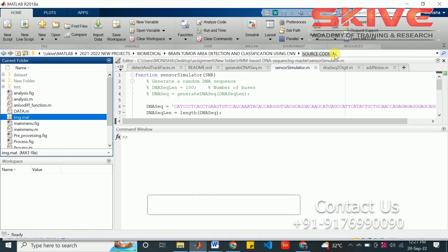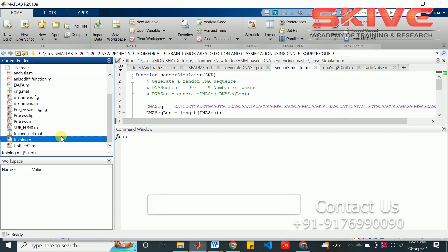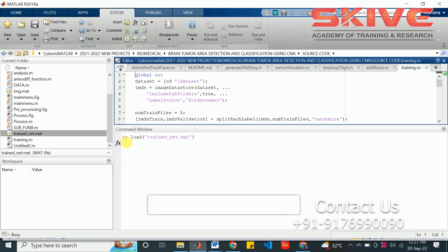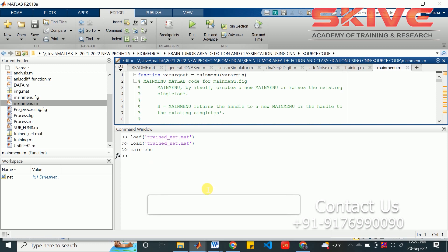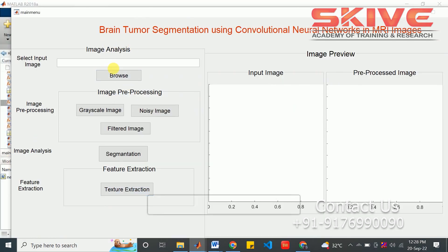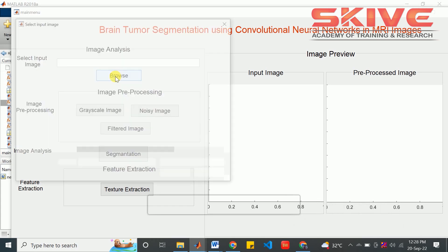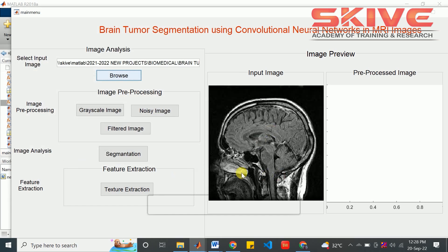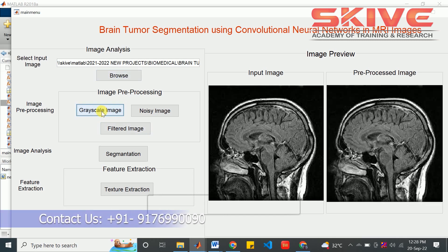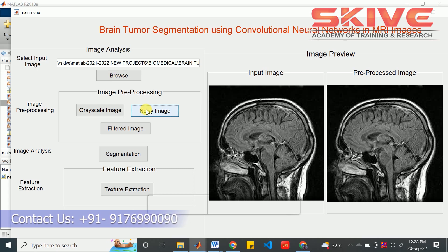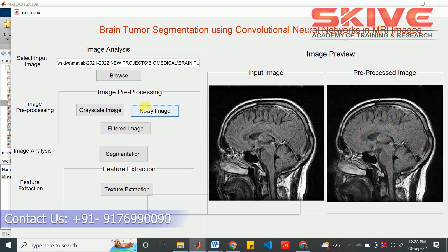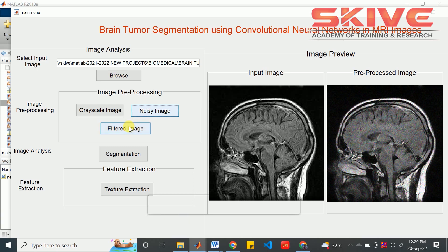Now we are going to see the implementation. This is a trained model and we can execute the project. First, we have to select the test image. The image is selected. Now we have to apply the pre-processing steps: the grayscale conversion and the noise removal process. This process will help in adding and removing noises from the image using the filtering process. By using the filtering process, all noise will be removed.